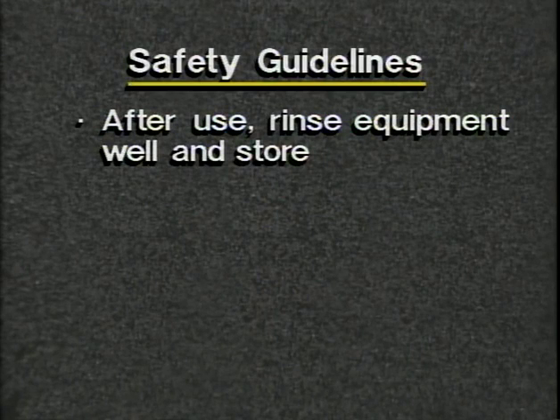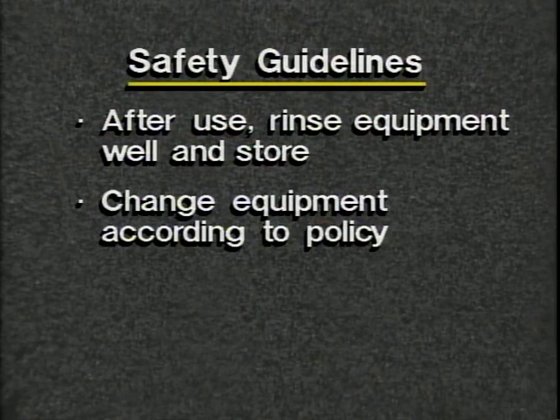Rinse the container and tubing well with hot water after administration. Allow the container and tubing to air dry completely. When dry, store the equipment in a clean covered box or wrap in a clean towel. Change equipment as recommended by the nurse or your agency's policy.